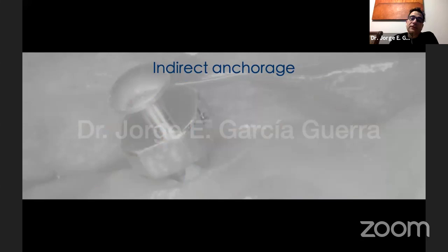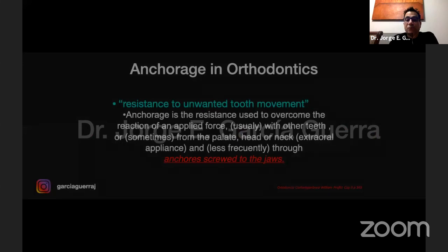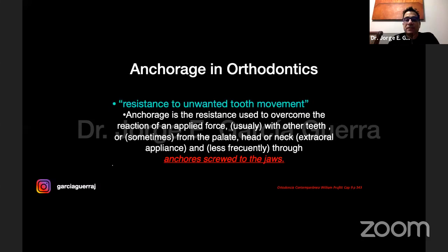Okay, and this is the beginning and the end for those canines that a lot of times give us a lot of problems. Okay, well now we understand that anchorage in orthodontics is the resistance to an unwanted tooth movement, okay?